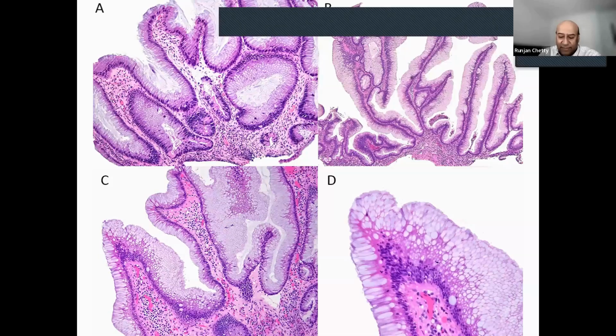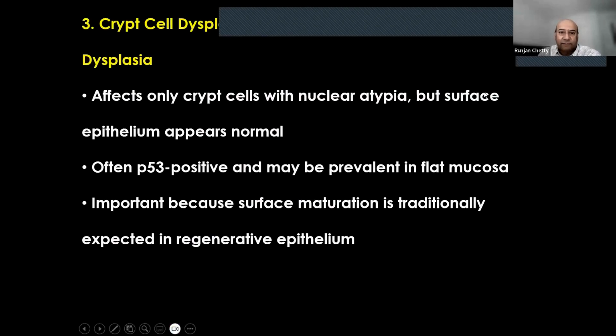But it's something to be really aware of, and look for areas with more conventional dysplasia, which may be comforting and really allow you to make the diagnosis that the entire lesion is made up of conventional dysplasia as well as hypermucinous dysplasia in other areas.